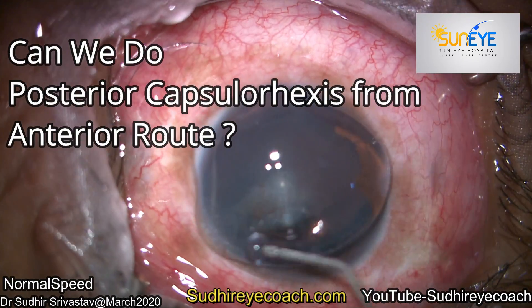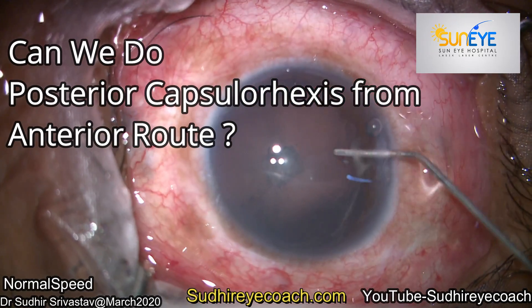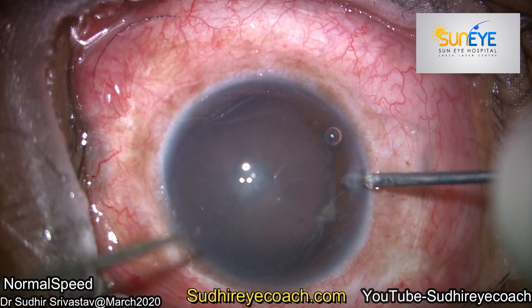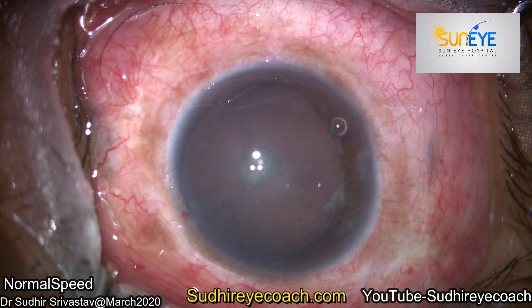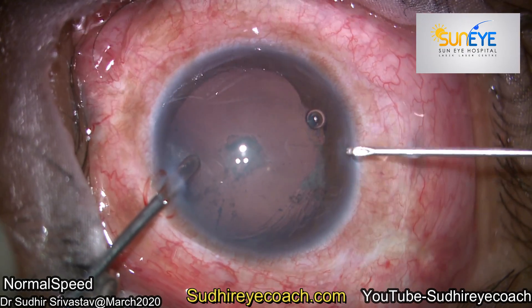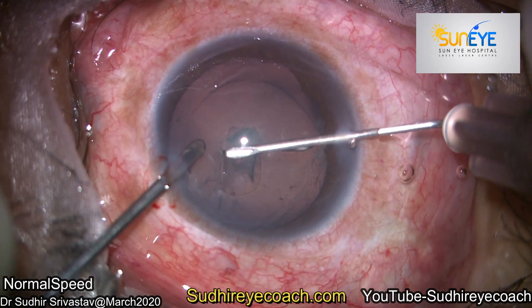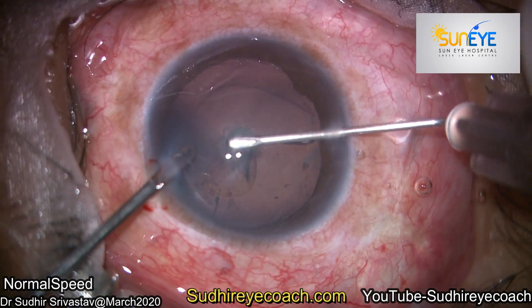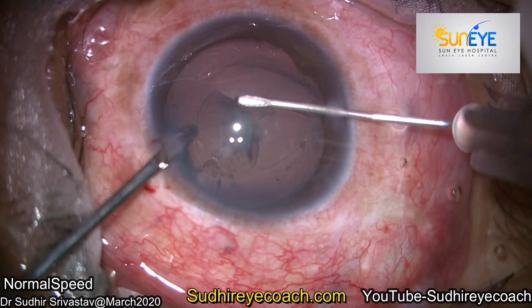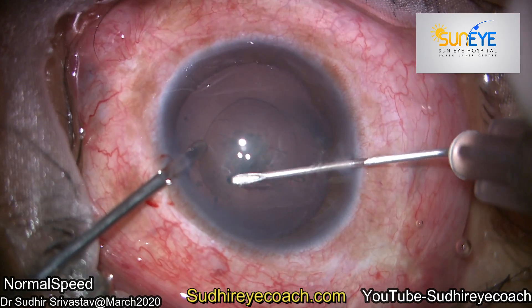Hello everyone. Today I will tell you what mistake I made while operating a cataract in a young myopic patient with a vitrectomized eye. He was operated earlier for retinal detachment surgery — pars plana vitrectomy was done, silicon oil was inserted, and after a few months the silicon oil was removed. The patient then developed a posterior subcapsular cataract.